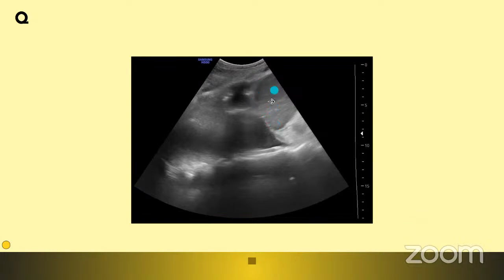So for information, this is the liver. Kidney is somewhere here, outside of the probe's view. This is the diaphragm. Okay. Here in this case, I should help you with the orientation, because I know how the ultrasound probe has been placed. So any idea? Suggestions, answers in the chat, please.